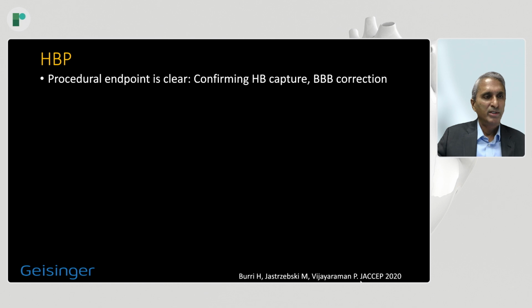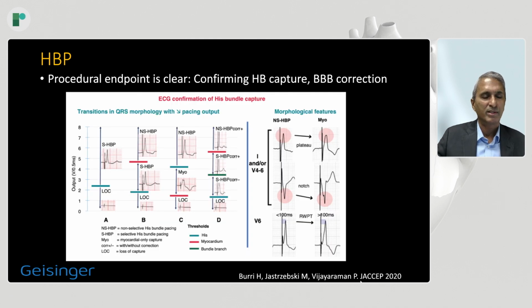The procedure endpoint is quite clear for patients with his bundle pacing, when we can confirm his bundle capture and bundle branch block correction rather easily. You can see that the criteria are different, but they're very straightforward and can be confirmed quite easily.